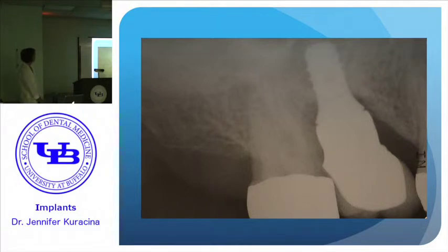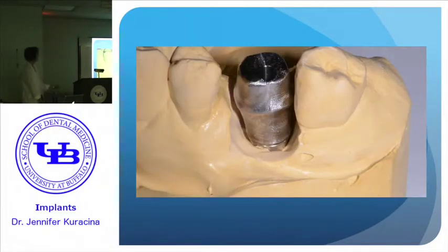This was a patient who came to see me who had a tissue level implant placed bone level and beyond. And this whole thing is the crown. It was placed on the solid abutment, and so there was cement and all kinds of crud down here, and the crown wasn't seated all the way. So obviously that wasn't a good idea, and this still isn't a great scenario, but this is what you would do to place the finish line in a better place.